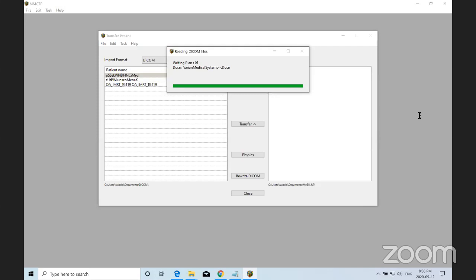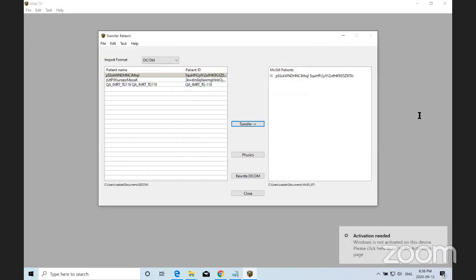I'm just looking at the code, Wameed, and actually, within the dynamic jaws CM, I have it so that it's reading in both the X and the Y field. So you can have two dynamic jaw CMs to define your different divergences for X and Y direction. So I will try it. Okay, so now this is done.